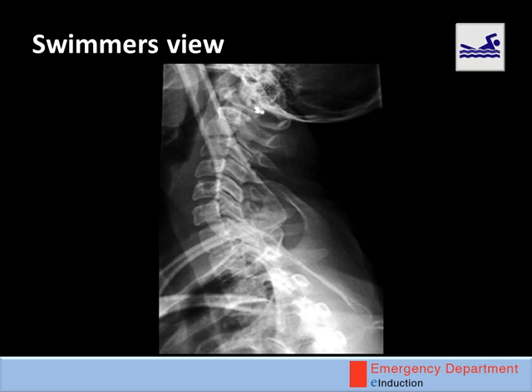We've not talked about other types of neck X-ray. Other than soft tissue neck X-rays for foreign bodies, we don't routinely do any other views such as flexion extension views. If you think this might be necessary, it's worth talking to a senior.